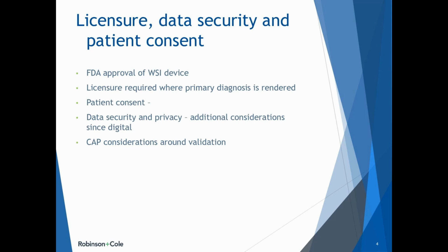That may also extend to patient consent. We're seeing movement in that area, with more transparency to patients and disclosures that may happen. Individual states may also have varying requirements for additional information regarding that, so that's important to check. The other important part is making sure that you're using a system that either is exempt from FDA approval or has FDA approval, and that you're following all of that. We're not going to get into the LDT rule today, but if there is any implication there, that as well.